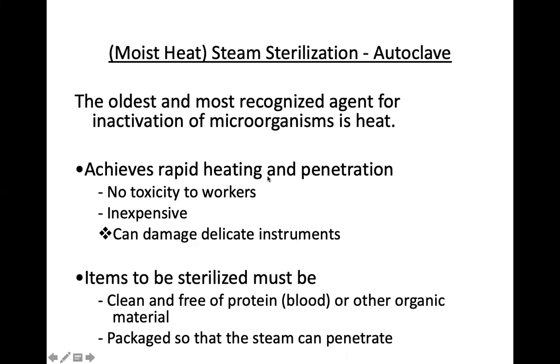There isn't a lot of risk to the workers who are using it. For the autoclave, once you maintain the machine well and set the temperature correctly, there isn't risk to the worker. They can only get burnt if they don't open and close it properly.